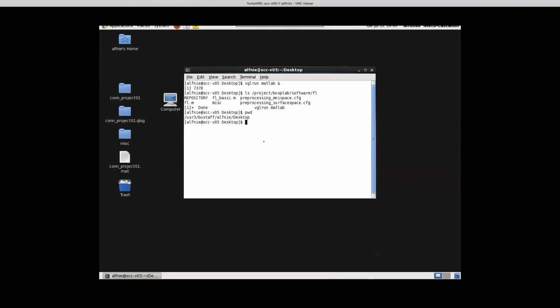Oh, okay. And then here's another question. This is a basic FreeSurfer question, which I just sort of assumed wasn't a question, but maybe it is. Because we do this all the time, right? We say, okay, we have a one-to-one mapping from a vertex in the subject space to a vertex on the FS average surface, and that's how we do our labeling.